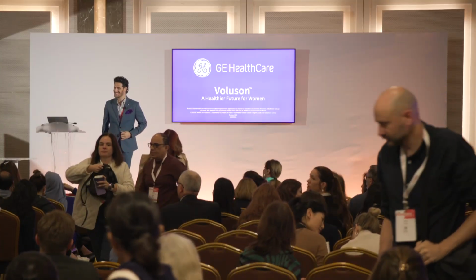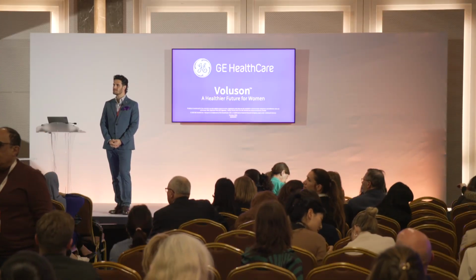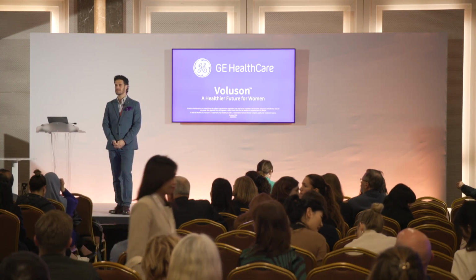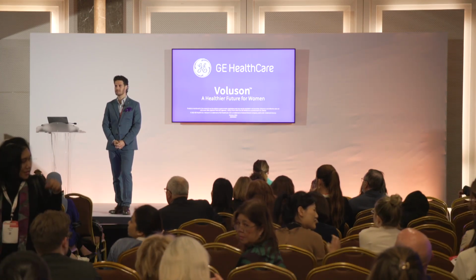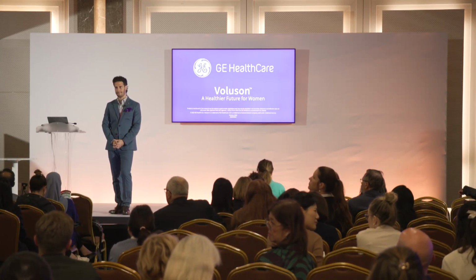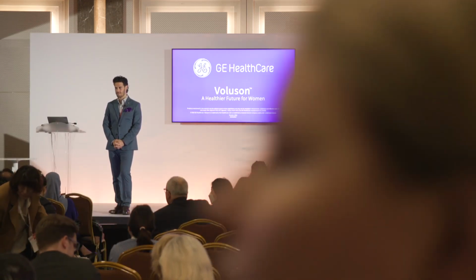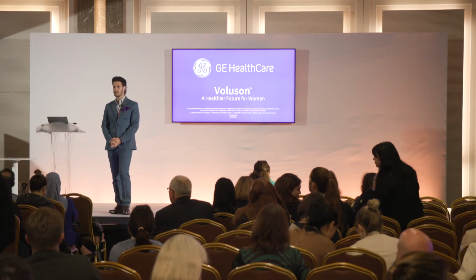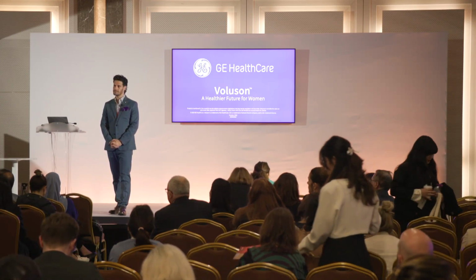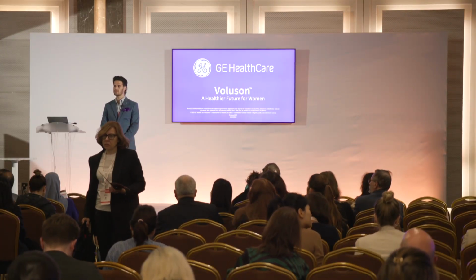Hi, Matthew. Very nice talk as usual. I just wanted to know, have you seen any difference when it comes to ovulation? Because after hearing your talk, I have been doing a little bit. But post-ovulation, my only concern is sometimes you have debris following a hemorrhage from a corpus luteum, and that could sort of mimic. So I'm wondering, even the post-ovulatory has the advantage that even if the tubes are blocked, you've got fluid, which cannot happen with saline infusion. But my only concern is, so I wanted to ask you your experience in post-ovulatory scans, correlation with surgery. Is there some difference? There's no literature on this yet.